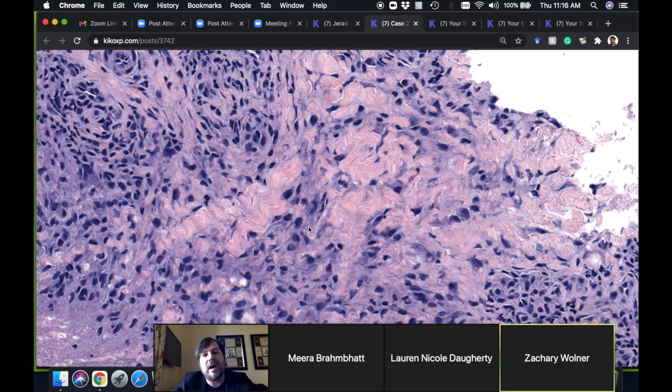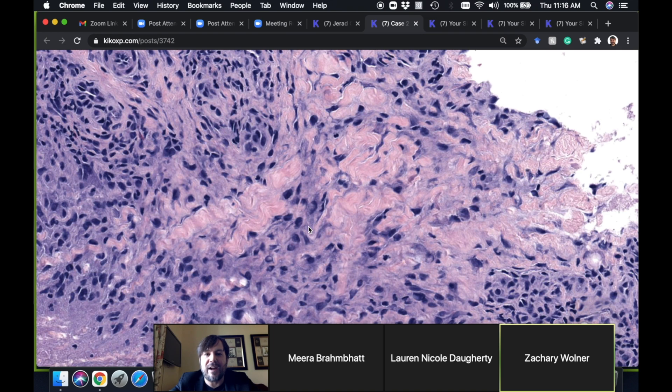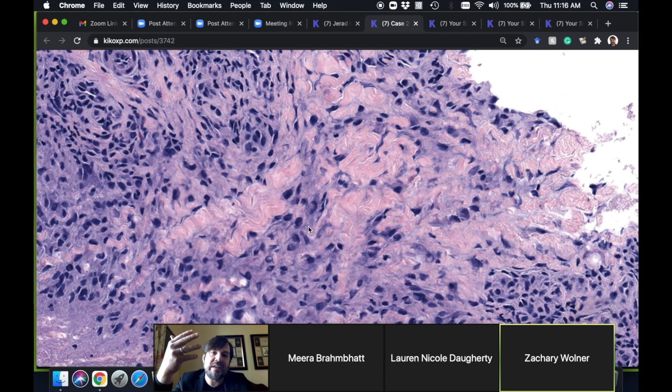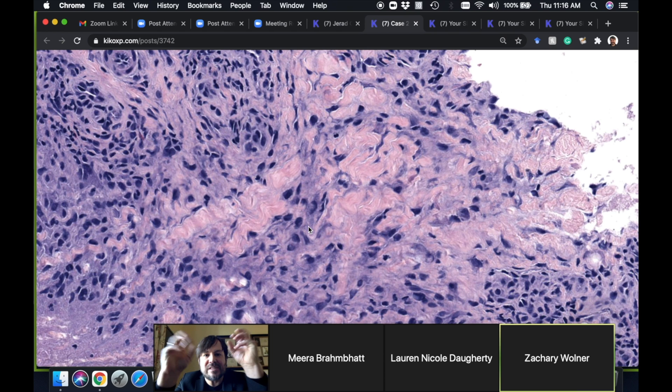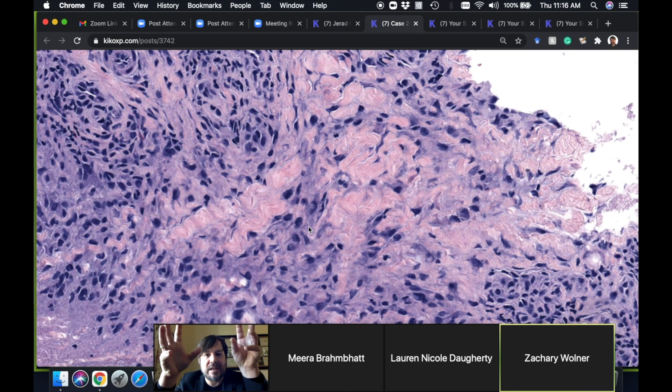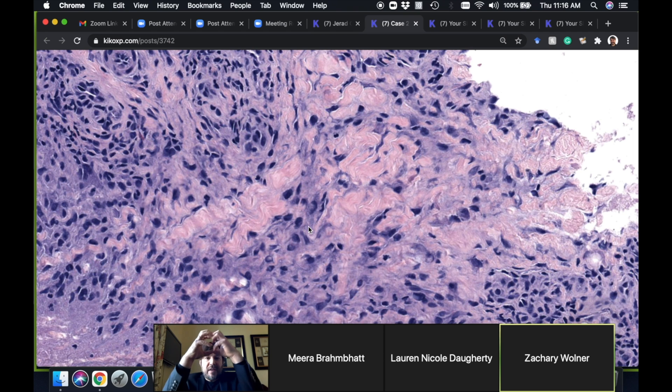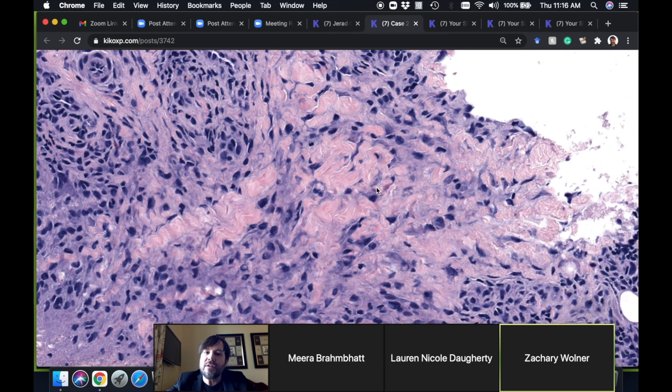I often can trick my residents into thinking that a GA is a dermatofibroma or vice versa, because at the periphery of dermatofibroma and the periphery of granuloma annulare you have a similar pattern of this fibrohistiocytic spindly histiocyte-look cells that are wrapping around and trickling in between collagen bundles.